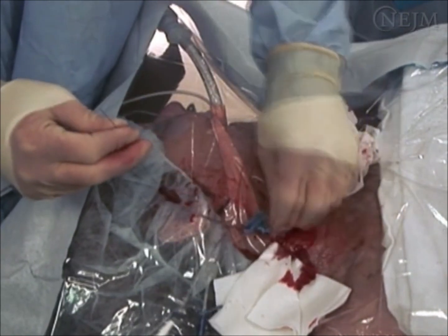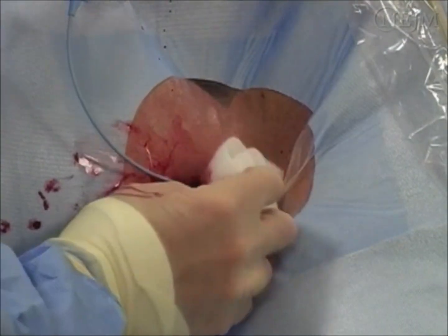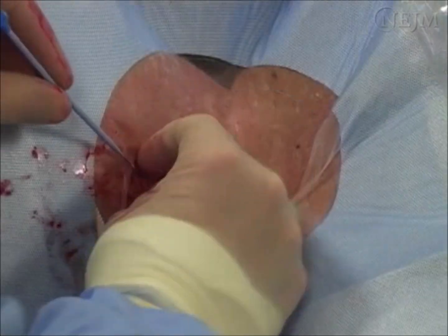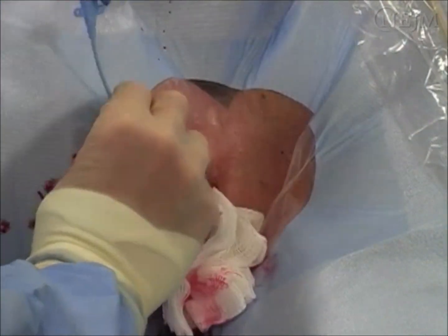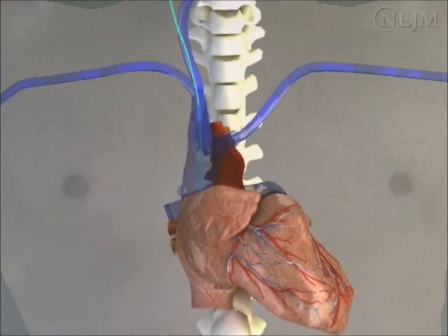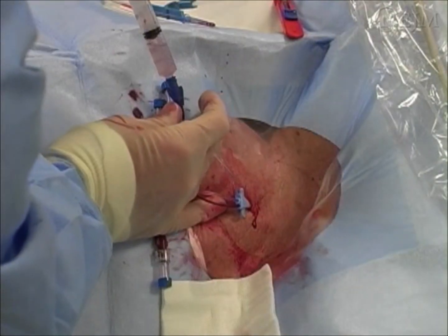If resistance is met, the tract may not have been adequately dilated. Remove the catheter and try again to insert the dilator. Insert the catheter to a depth that places the tip at the junction of the superior vena cava and the right atrium. Remove the guide wire and check for blood return in all ports.